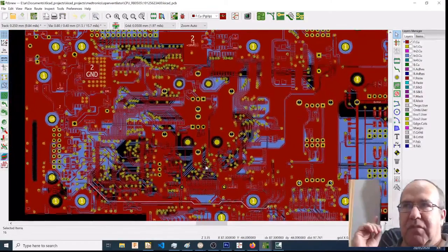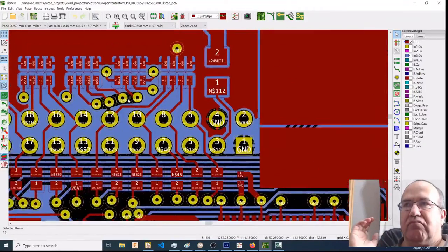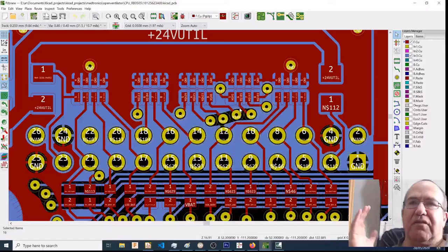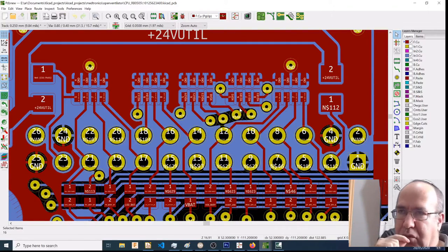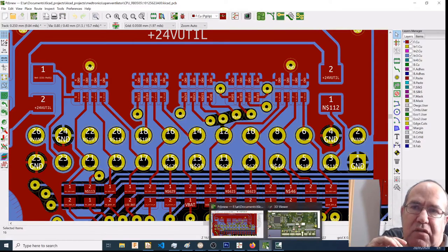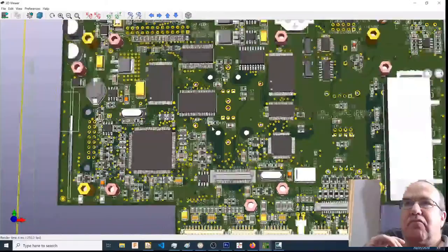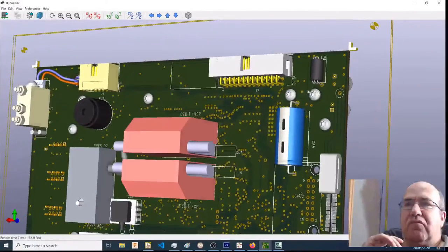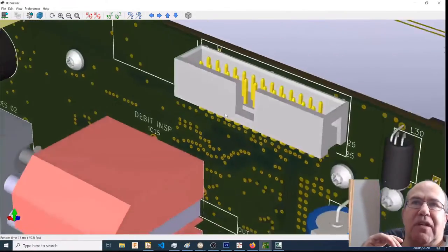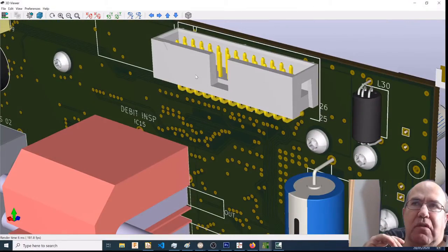What did I want to say about this? Okay, I have now moved to the top of the board. The top of the board, if one's going to look at it in this point in here, I've come in to where the power comes into the board. The power comes into the board on this connector here.